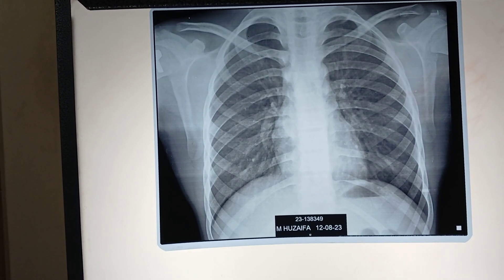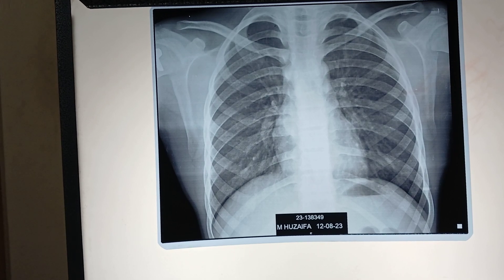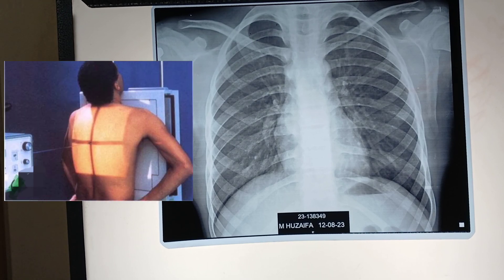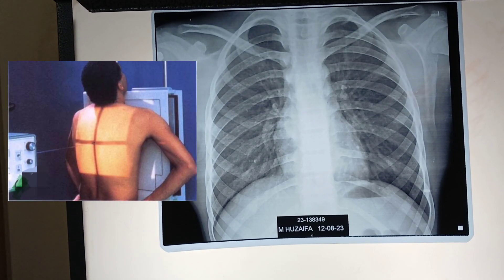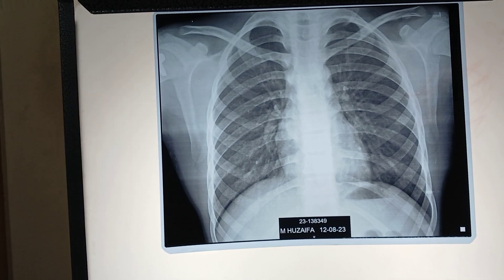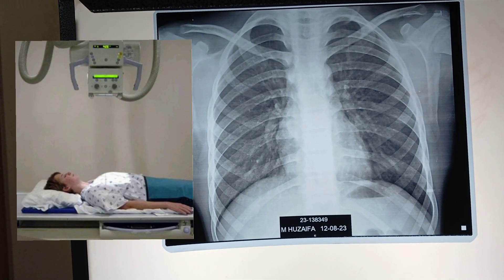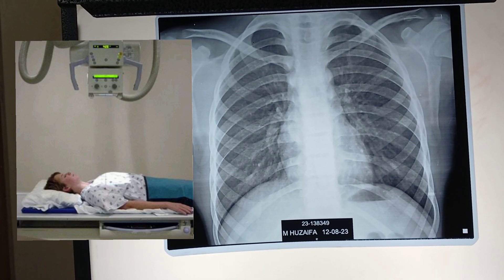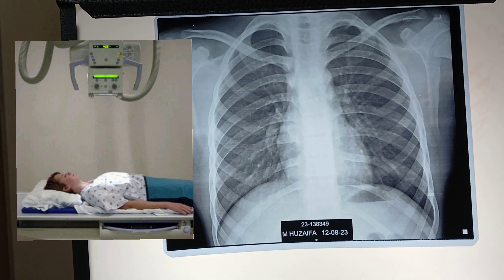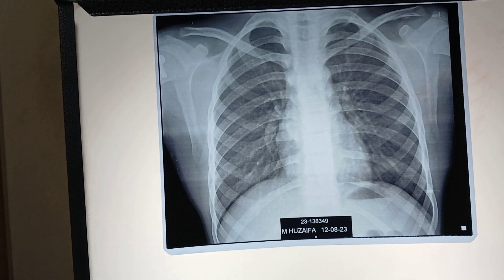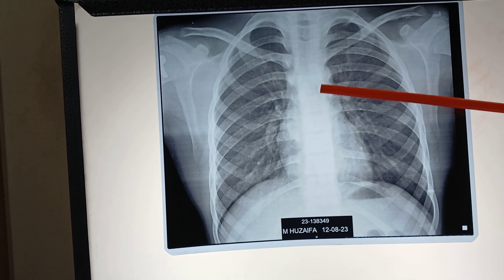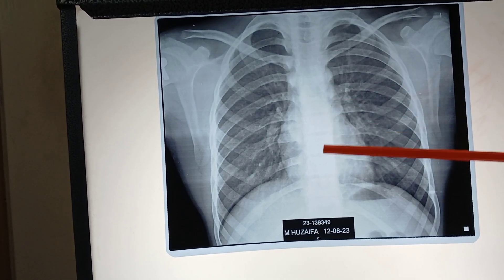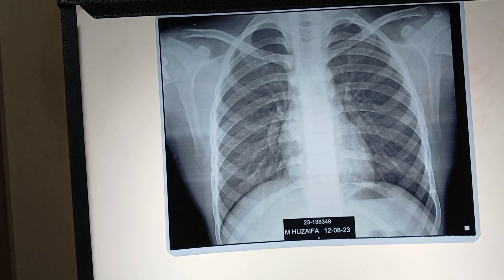The next step in quality assessment is projection — to see whether the film is AP or PA view. PA view means postero-anterior view, in which X-rays enter through the back and the cassette film is along the anterior aspect of the chest. The opposite is the AP film, in which the beam enters from the front and the film is on the backside of the patient. AP views are taken for patients admitted in ICU who are not able to stand, or for sick patients. With proper exposure, the spine should be barely or faintly visible behind the heart. If the vertebral bodies are clearly visible, the film is overexposed.